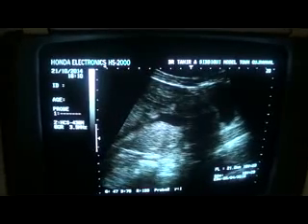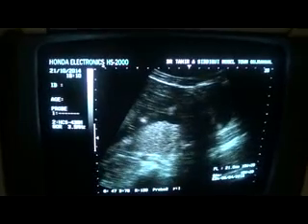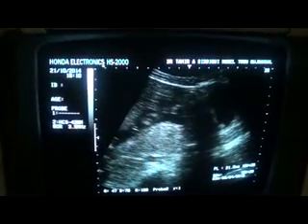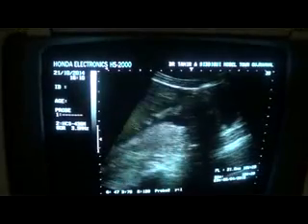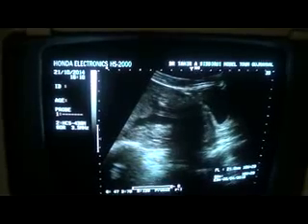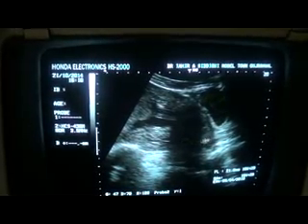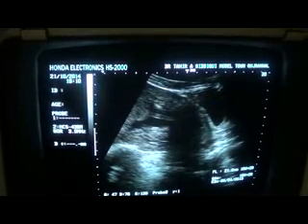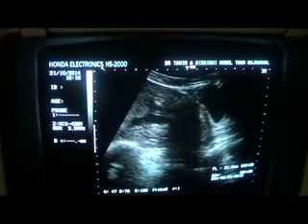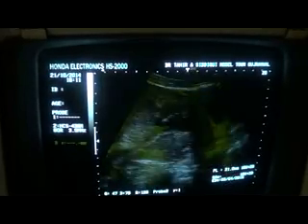Now this ultrasound study is that of a primary gravida, 16 weeks gestation, female, length 2 centimeters. What we are seeing is that this is the urinary bladder, this is the cervix, the vagina. I have aligned the uterus to the vagina, and this is the anterior myometrium.